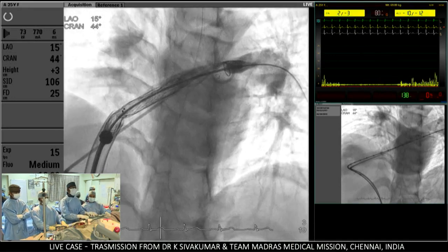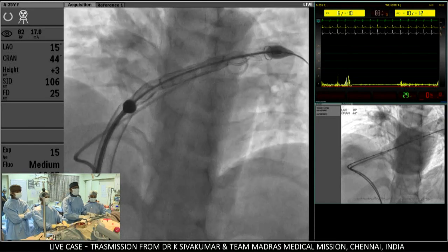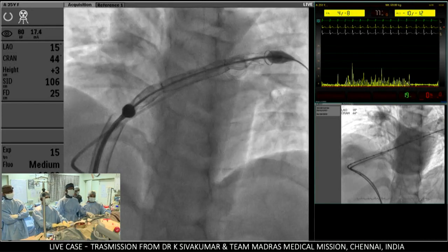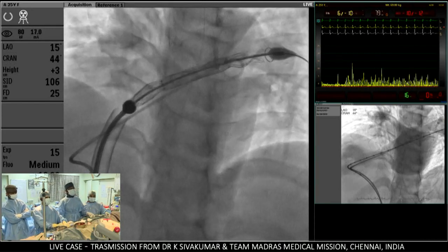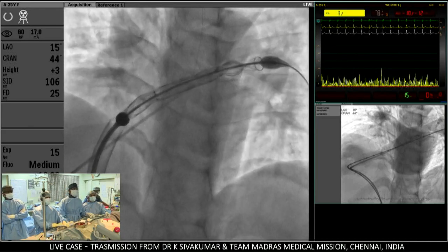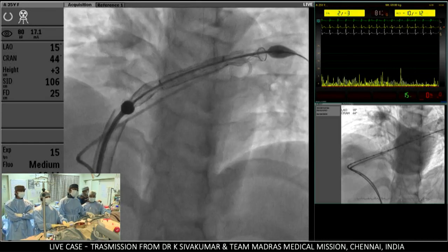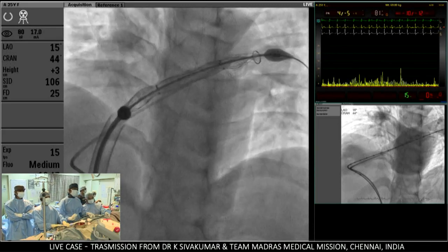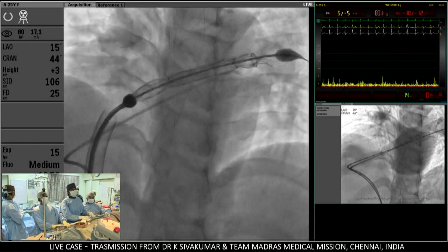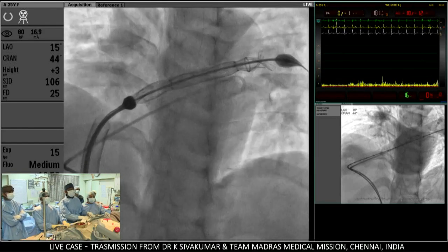Shiva, actually I came late, sorry for that, but it's quite challenging, huh? And Cici is sitting with me, by the way. So the plan, I totally agree with Mario that we probably will go to the long waist, which will hold the valve. I'm not sure about the size because I didn't come early, but 30, 32 should be a reasonable one. The challenge will be, we may try to open more flare, distal flare, a bit more distal, and then we try to pull back. That will give us room for moving downward. So that's probably my thought at the moment.